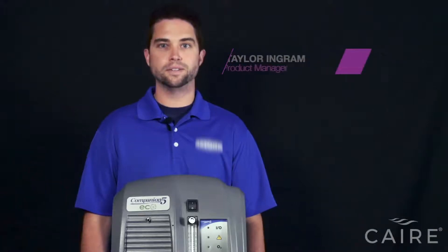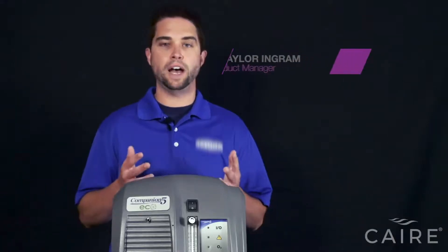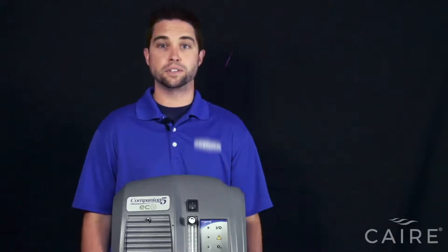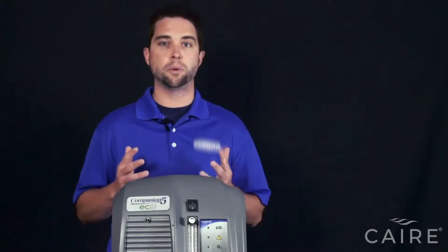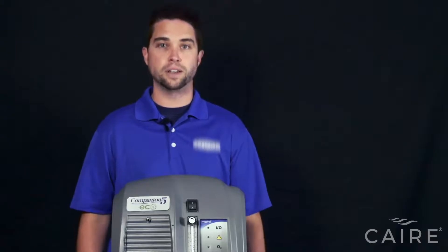Hello, I'm Taylor Ingram with CAIR. Today we're going to go over the Companion 5 stationary oxygen concentrator and its basic operation. The Companion 5 produces flow rates up to 5 liters per minute and is the most technologically advanced stationary on the market. Let's get started.